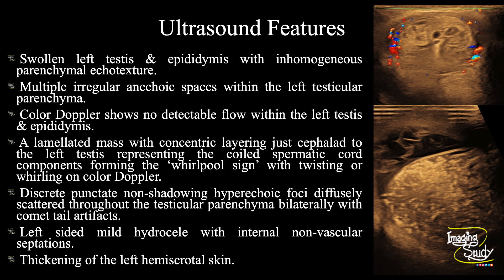In summary, the left testis and epididymis are swollen with inhomogeneous parenchymal echotexture. Multiple irregular anechoic cystic spaces are seen within the left testicular parenchyma. Color Doppler shows no definite vascularity or detectable flow within the left testis and epididymis. There is a lamellated mass with concentric layering just cephalad to the left testis representing coiled spermatic cord components forming the whirlpool sign on color Doppler. Discrete punctate non-shadowing echogenic foci are seen diffusely scattered throughout the bilateral testicular parenchyma with comet-tail artifacts indicating testicular microlithiasis. There is also left-sided mild hydrocele with internal non-vascular septations, and left hemiscrotal skin is thickened. These features conclude this as a case of left testicular early sub-acute torsion with reactionary hydrocele and bilateral grade 3 or diffuse testicular microlithiasis.